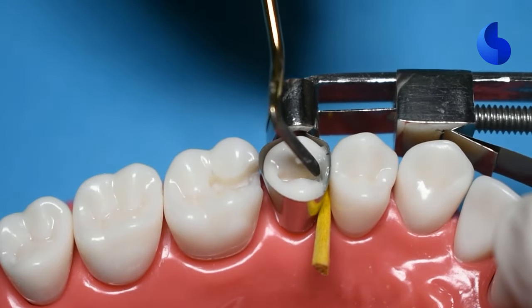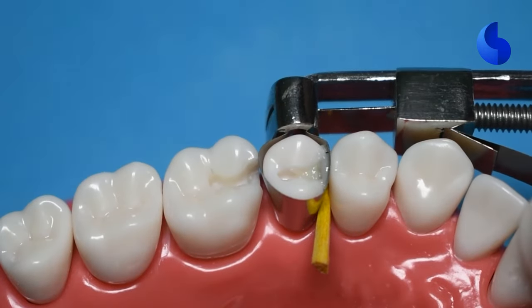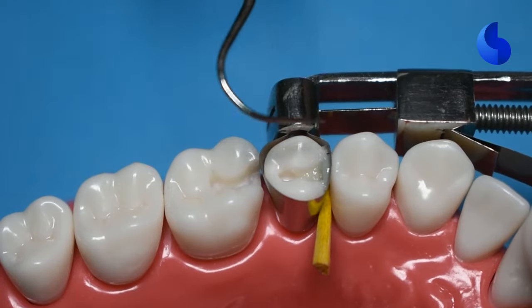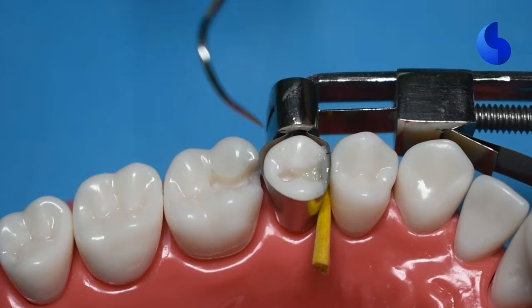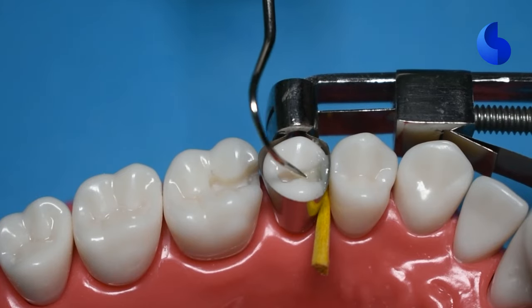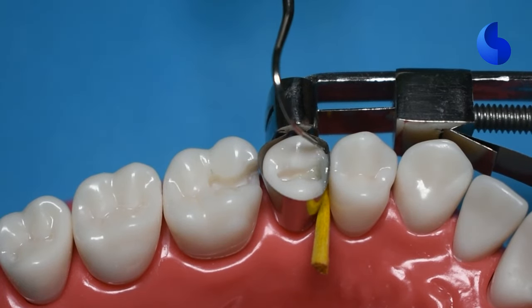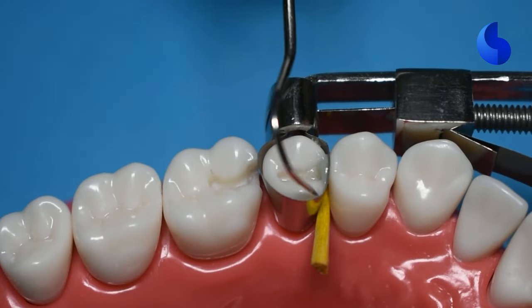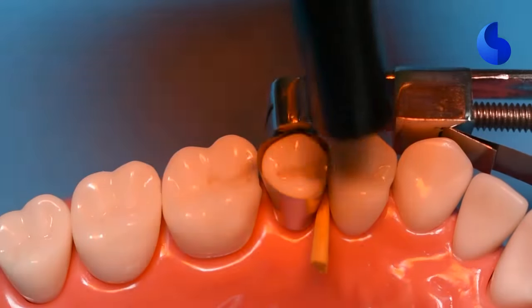When you're doing this, you can notice how some flash is moving to your buccal and lingual surfaces. The best way to remove this is by using an explorer here and then running it in that gap and removing that excess material. It's always good to do this when the composite material is still workable and fluid, and you can also remove flash that's flowed onto the occlusal surface as well, because it gets much harder once you cure this material.